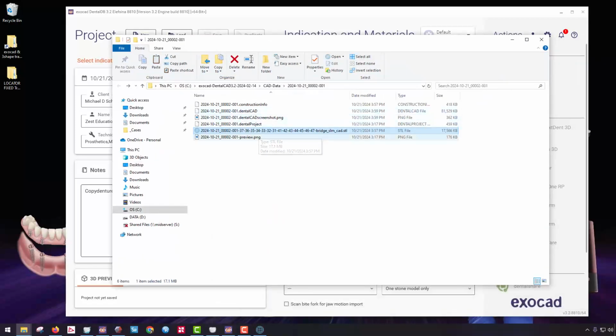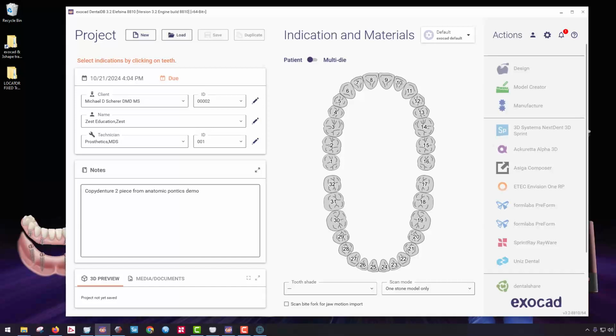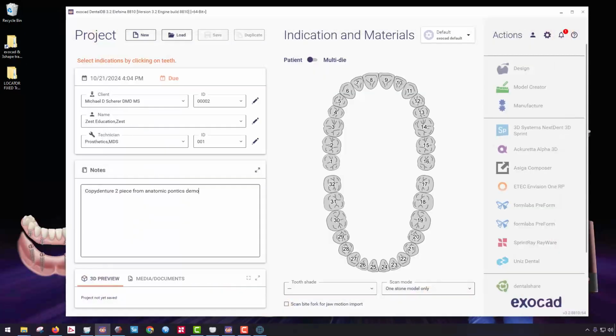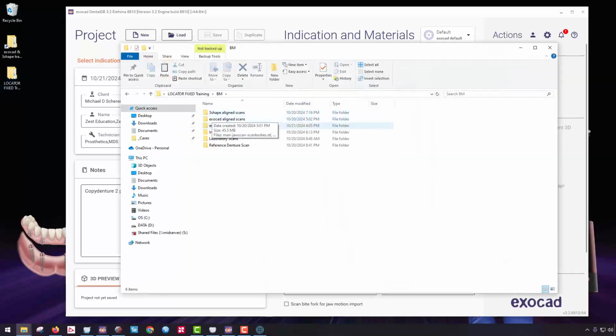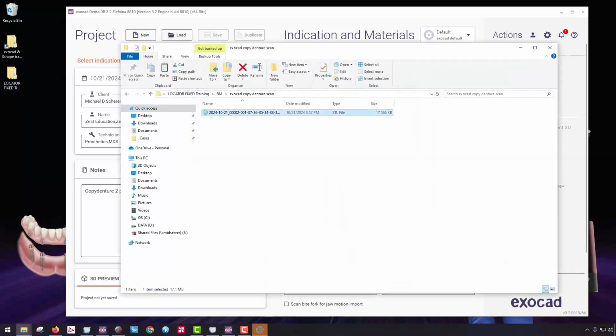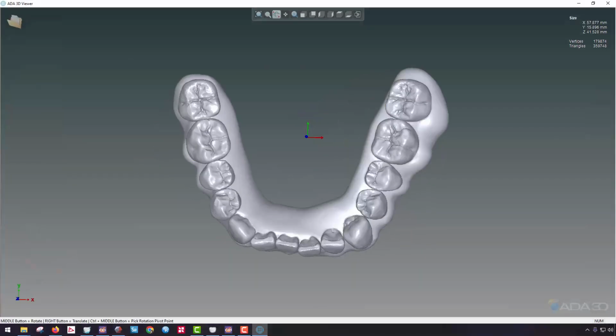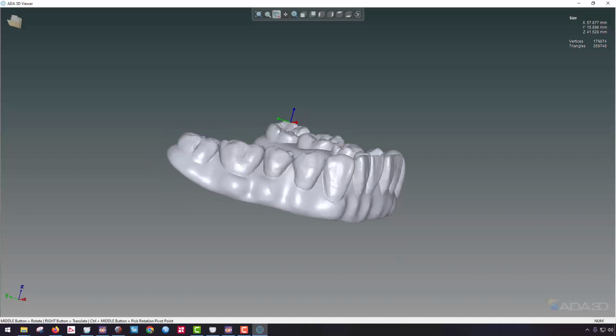So my original was right here. This is what I showed in exocad, how to get there. If you get lost, pull up your load function and find it on your previous design file. And I just copied that into a folder on my desktop. Now I'm going to open up that folder, exocad copy denture, and inspect my STL file. Here's my STL file. I've got tooth number 18 through 31, just like I showed in previous examples.